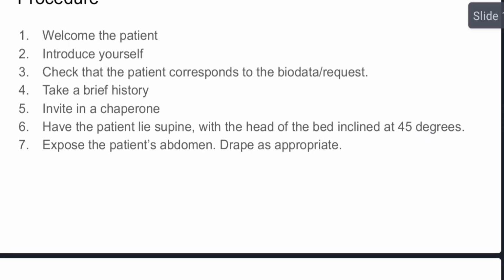Expose the patient's abdomen and drape as appropriate. Of course, we do realize that in certain clinical scenarios, you may not follow this to the letter, but you should welcome your patient, make them feel comfortable, introduce yourself, and then have a chaperone present.